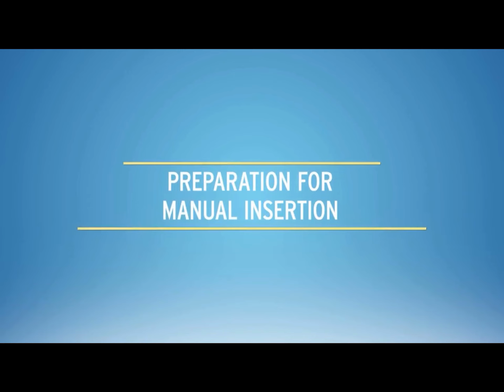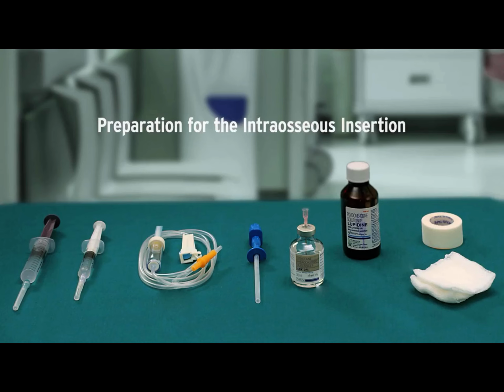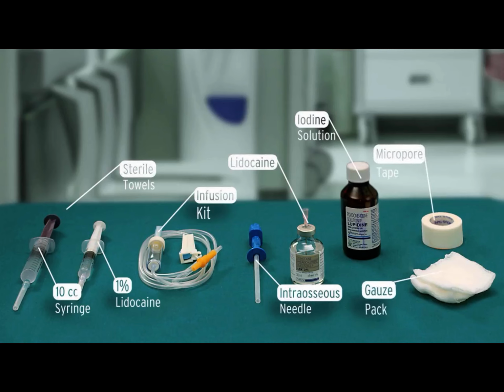Preparation for manual insertion: The following things are assembled in preparation for the intraosseous insertion: sterile towels, a 10 cc syringe for aspiration and infiltration, 1% solution of lidocaine for analgesia, infusion kit, intraosseous needle, iodine solution, micropore tape, gauze pack.